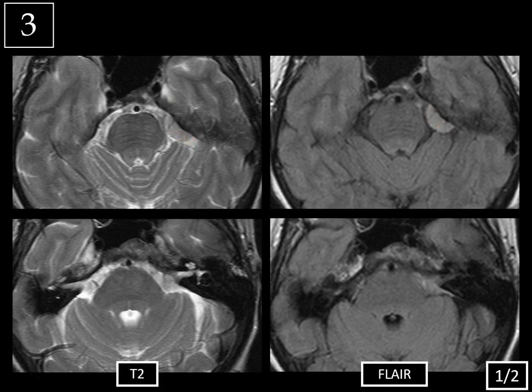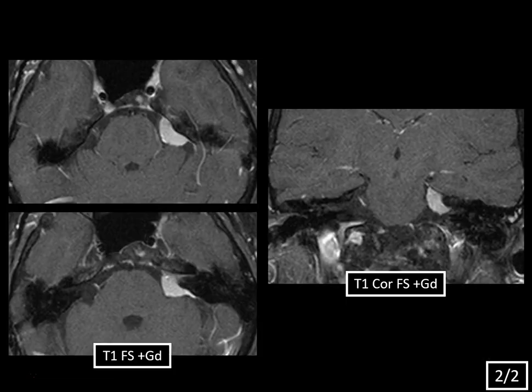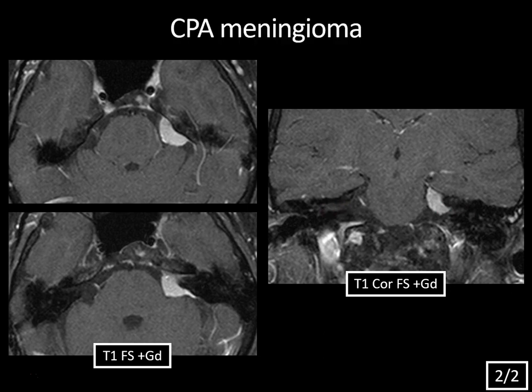What do you think about the signal intensity of this mass? It looks isointense to gray matter — the cortex of the brain — and there's also dural thickening inferiorly. When we give contrast, the mass is diffusely and very homogeneously enhancing. It's slightly extending into the internal auditory canal but is not centered within it — here's the normal right internal auditory canal for comparison. This is typical for a cerebellopontine angle meningioma.